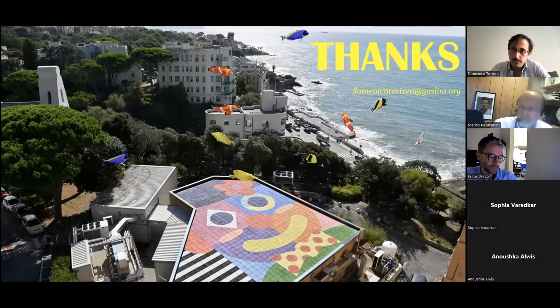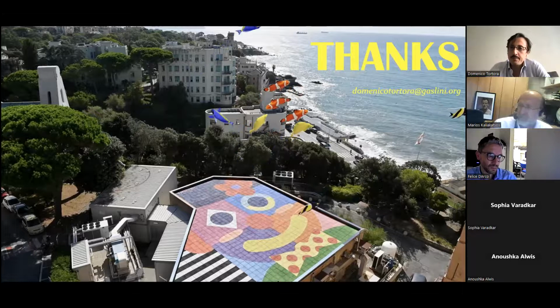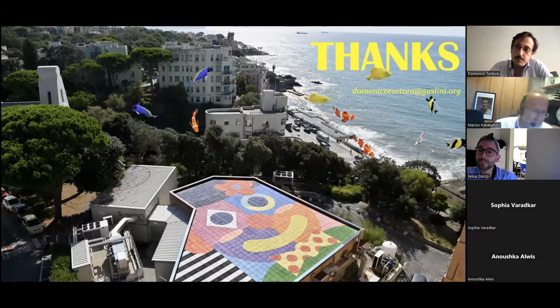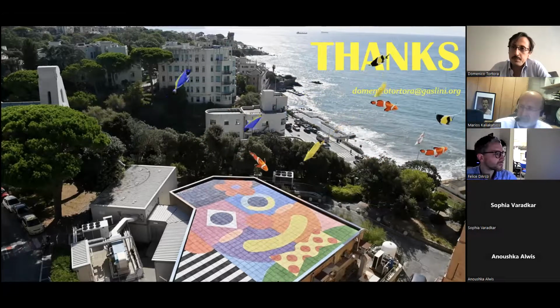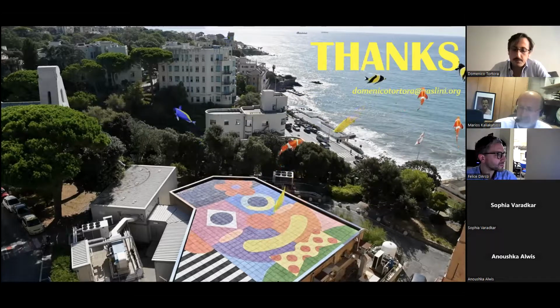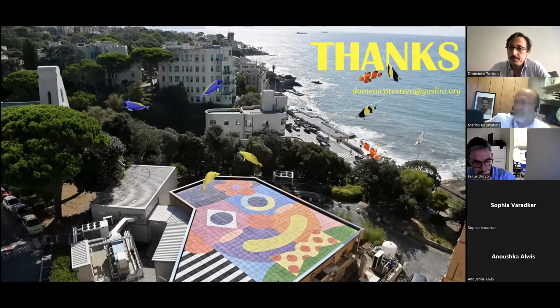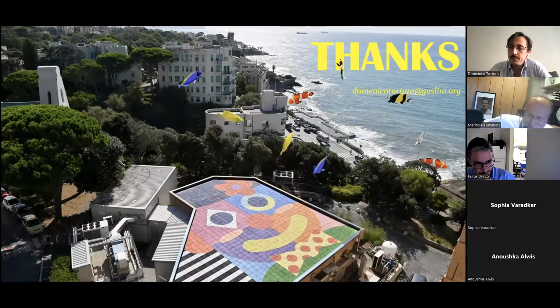Anushka, do you want to go on and ask your question? Hi, Domenico. Thanks for a really excellent presentation. My name's Anushka, and I work as part of the neurovascular service here at GOSH, including looking after patients with moya-moya. And one particularly challenging group of patients we have are those with asymptomatic moya-moya. And I wondered if you thought there was a role for ASL in informing decision-making around this patient group.